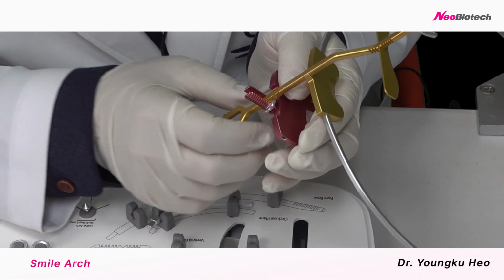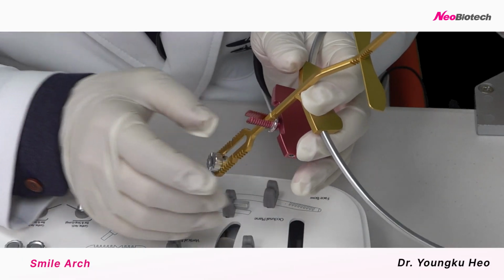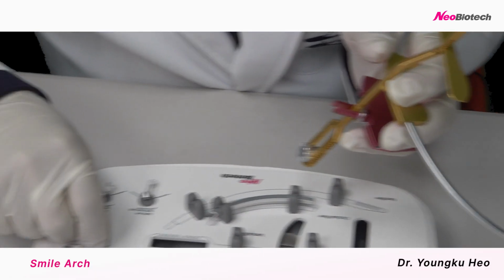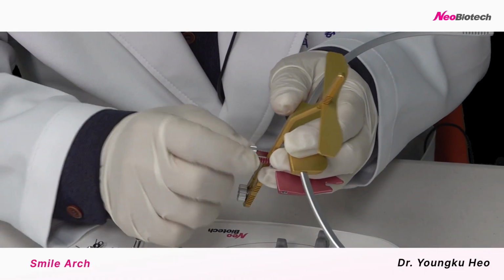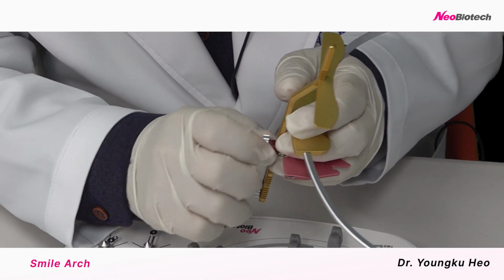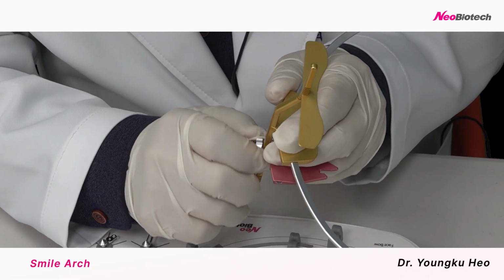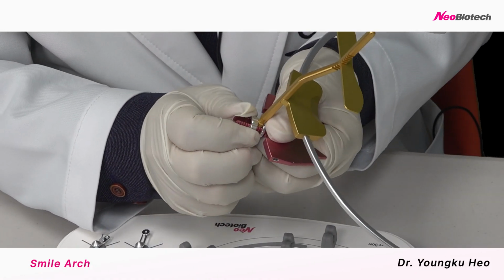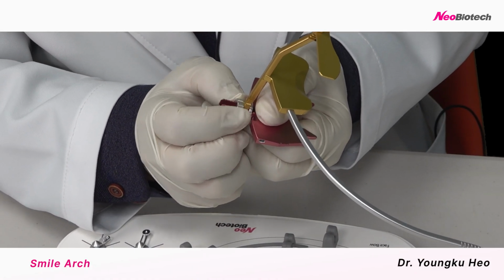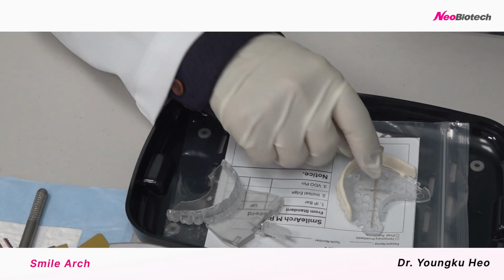All right, like this, and then you can put it like this.